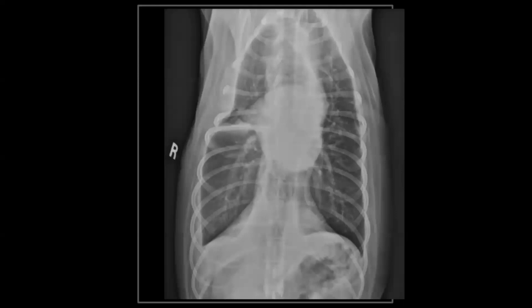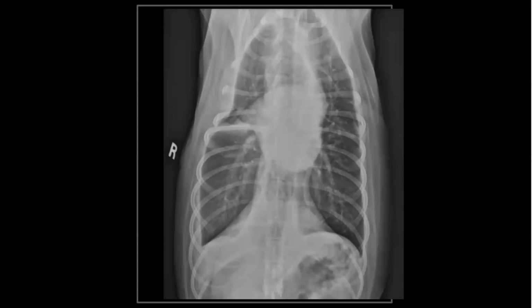And this is a case that's a little bit more interesting, where no doubt on the cranial right side of the thorax is some significant fluid accumulation. However, importantly, on the left side, you can see a wispy amount of interlobular fluid. I'm trying to get the mouse to work, but the mouse isn't operating. But on the left side is a wispy amount of fluid, and that would be a positive for pleural effusion.